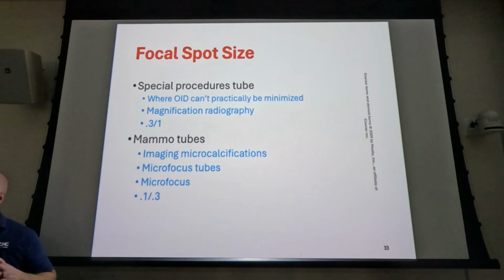Well, yeah, but the display might be unchanged because now everything is processed through the computer, so it might not show as much magnification on the image as it did before. You can digitally magnify it, right? But if it doesn't show that magnification, is there still a loss of sharpness of recorded detail?